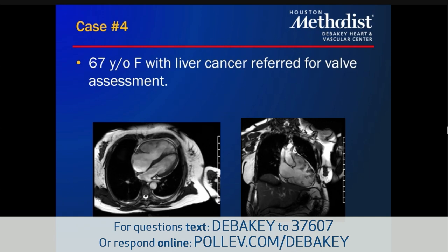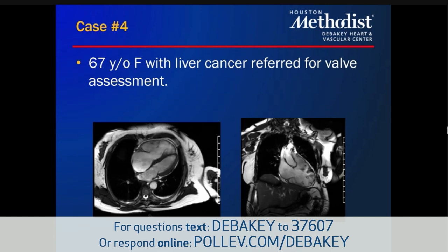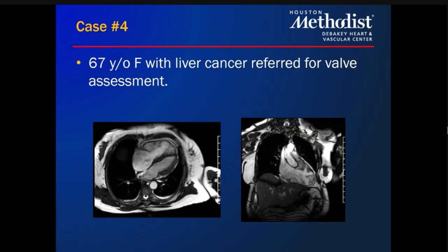Yeah, so I can see that the right side of the heart has enlarged chamber sizes, definitely marked enlargement of the right atrium. I would say the RV also looks larger than the LV cavity. I would add, in terms of function, I think the wall motion looks fairly normal, both right and left. Contracting appears normal. I get the feeling George is trying to be thorough, but he's beating around the bush. There's a clear abnormality here.